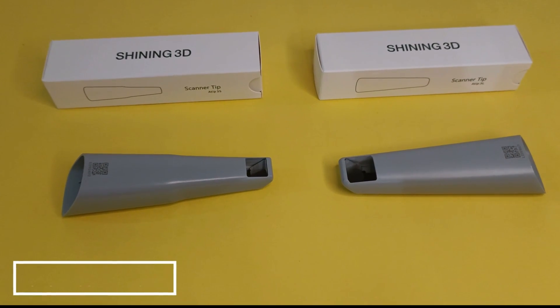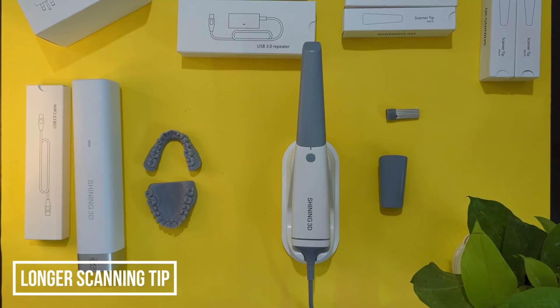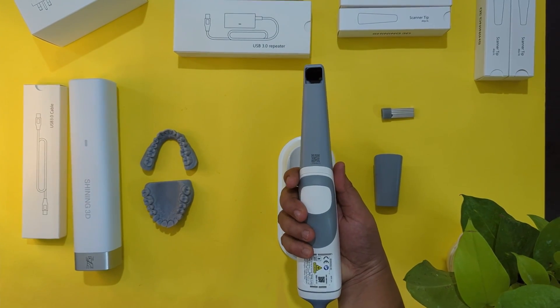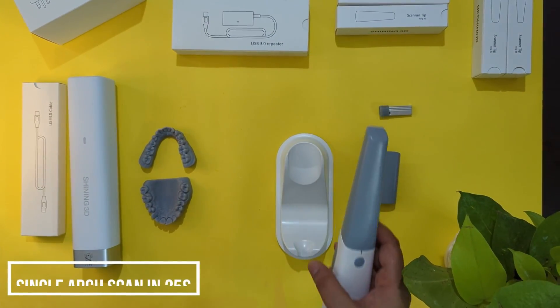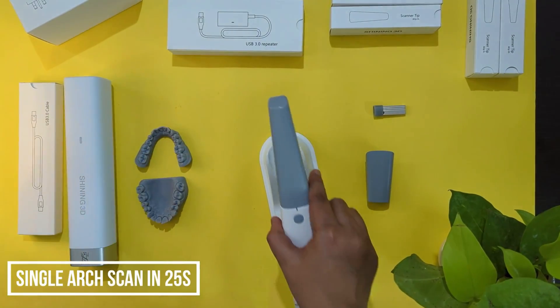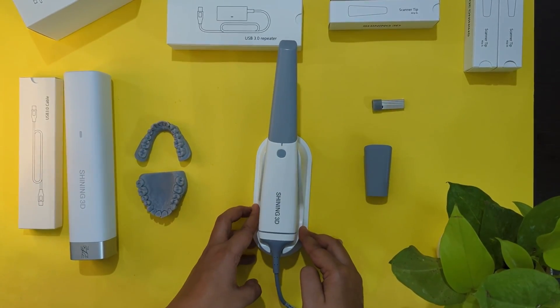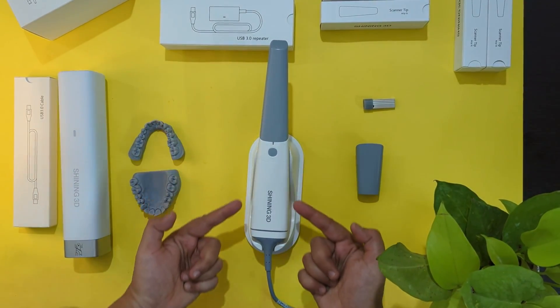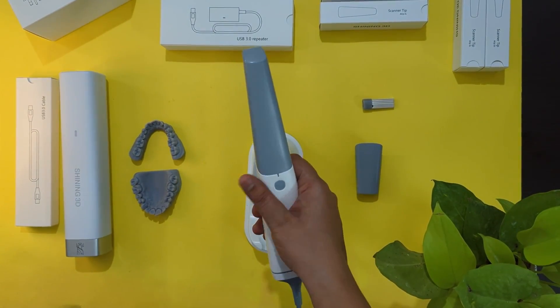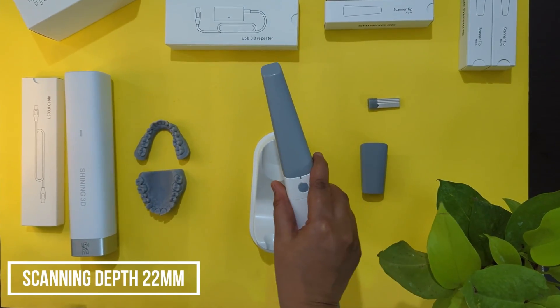It has longer scan tips, which is why we can reach deeper areas of the oral cavity like the second and third molars. A single arch scan is possible in just 25 seconds, so a full-mouth scan takes just 50 seconds — though it does require skill and there is a learning curve. The scanner has a very sleek design and the scanning depth is amazing, up to 22 millimeters.